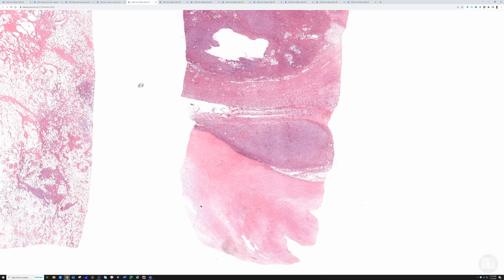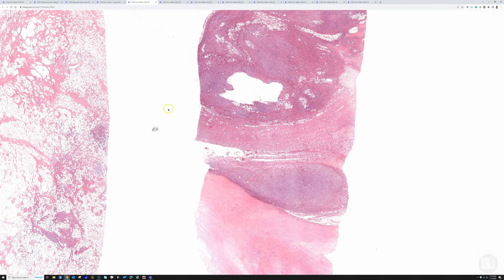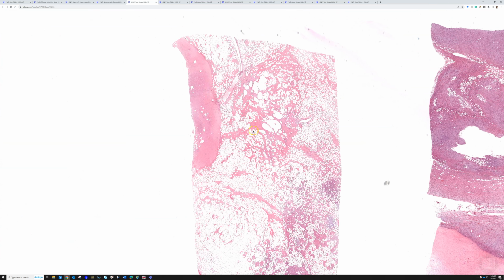Other people may disagree, but that's the way I think of it, because dedifferentiated liposarcomas are relatively common as sarcomas go in adults in the retroperitoneum, okay? But in this case, we can tell also that the answer is dedifferentiated liposarcoma because we have a high-grade sarcoma plus, right next to it, we have well-differentiated liposarcoma. And there are three main things we look for in well-differentiated liposarcoma.